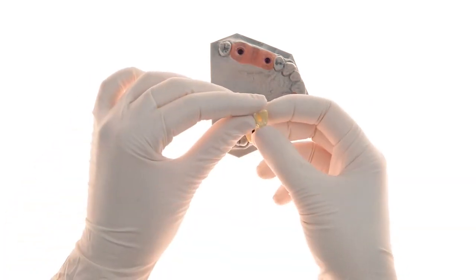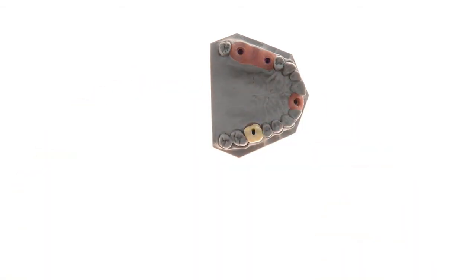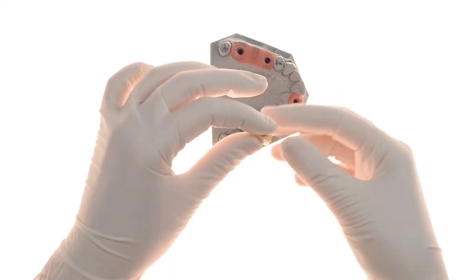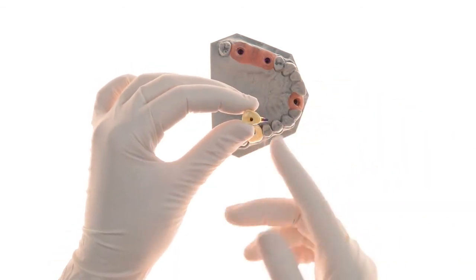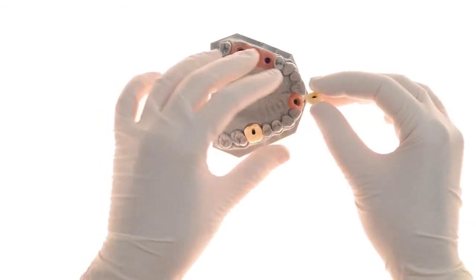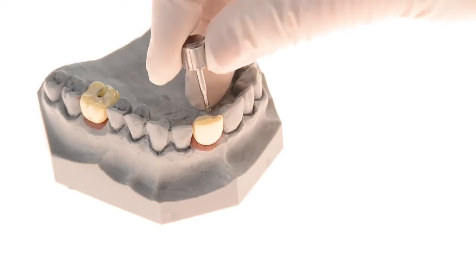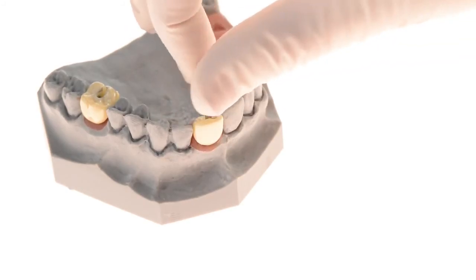Following the scanning, a custom-made restoration may be designed and milled, which includes the planned opening for the screw channel. Once the restoration is milled, the screw is positioned inside the adjustable EasyBase, then the restoration is cemented to it. The entire assembly may now be screwed to the implant.